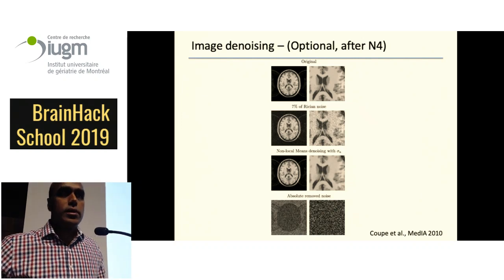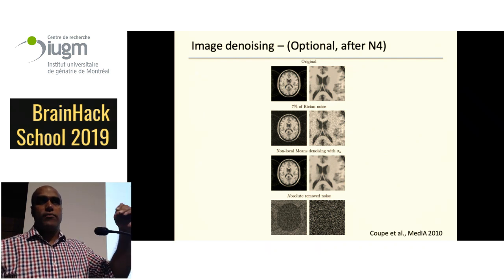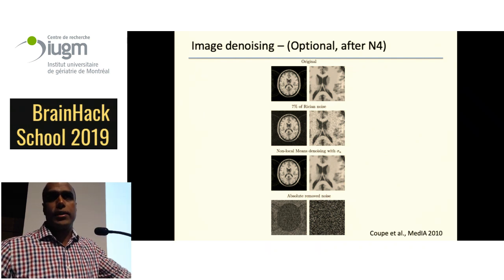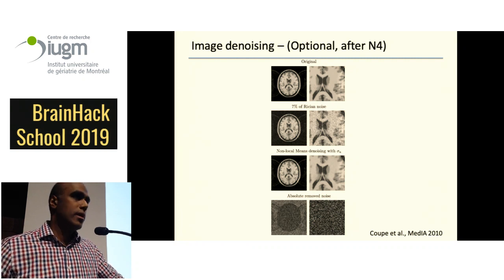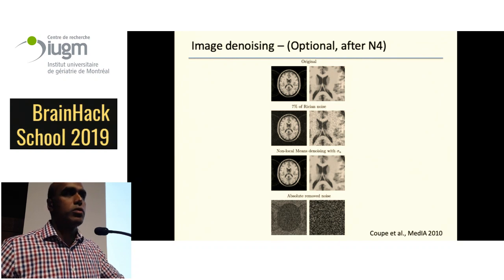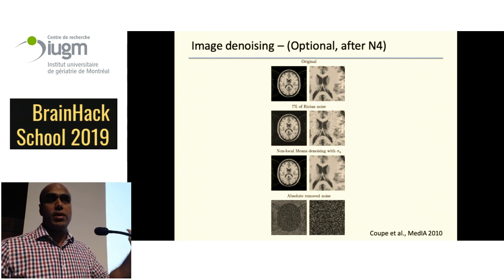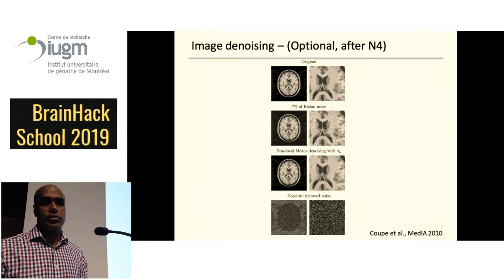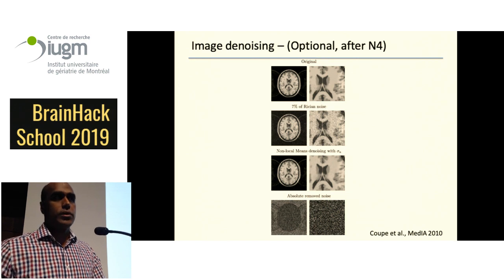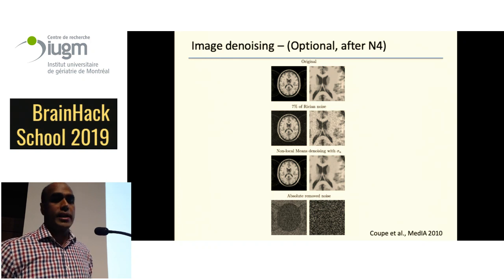We find this useful in some contexts and not others. In the case of cortical thickness, for example, it really shifts the boundary from before to after, so we don't use it in cortical thickness estimation at all. A lot of our results say something very robust, like if you take 200 people aged 5 to 85 and look at cortical thickness as a function of age, this seems to make it disappear if we use this as a pre-processing step, right? For segmentations, however, we find it can be quite helpful. It doesn't really shift boundaries that badly there. So just something to keep in mind. It's there if you want to use it.